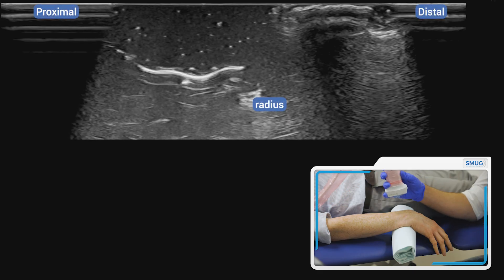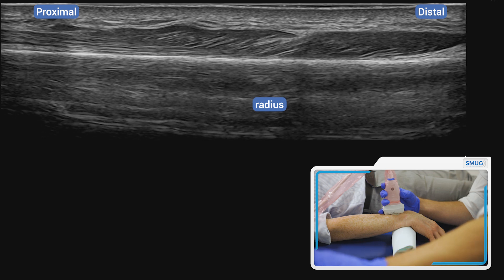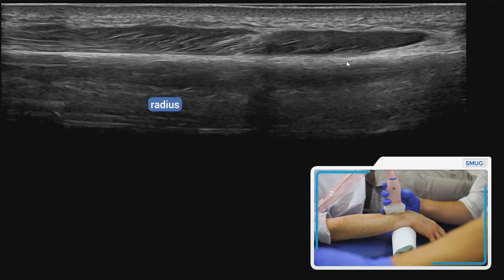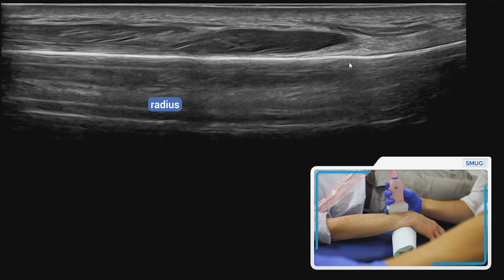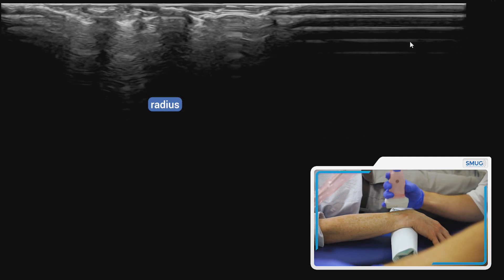To carry out the procedure, it's good just to start in a longitudinal section. If you just line up with the radius, this is a nice landmark to find. All you then need to do is slide off distally until you start to see the distal end of the radius.